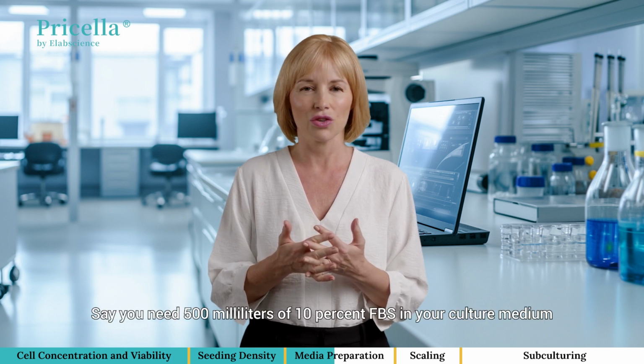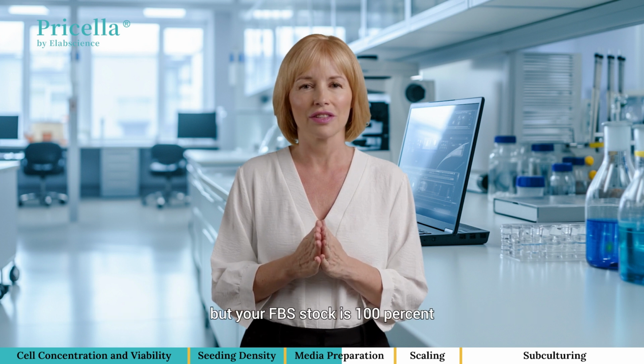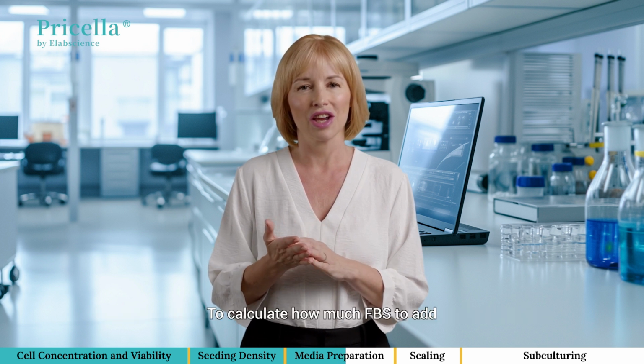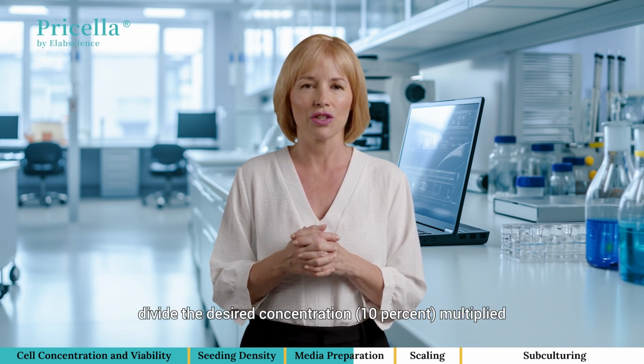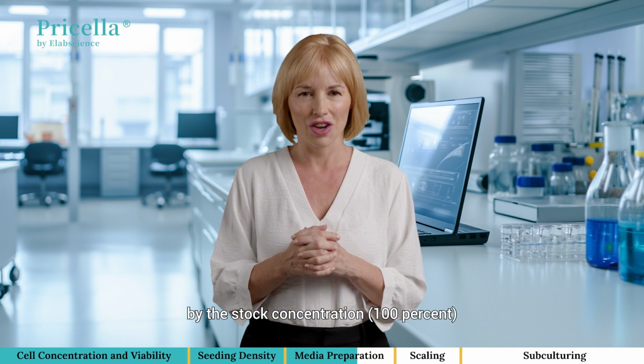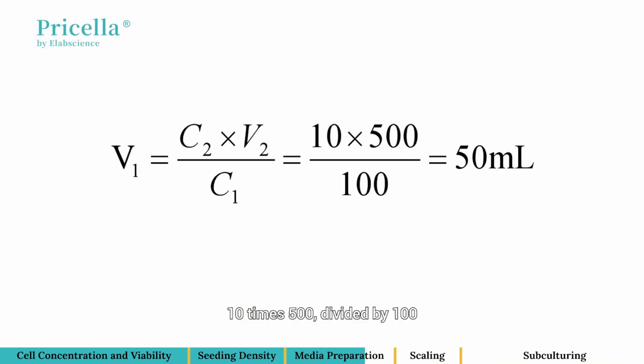Say you need 500 milliliters of 10% FBS in your culture medium, but your FBS stock is 100%. To calculate how much FBS to add, divide the desired concentration multiplied by the desired volume by the stock concentration. So, that's 10 times 500 divided by 100. The answer is 50 milliliters of FBS.